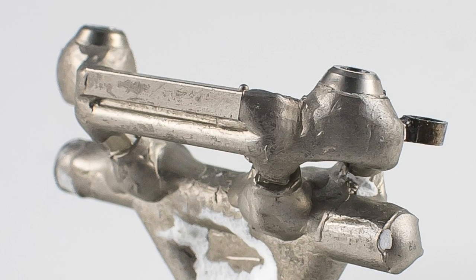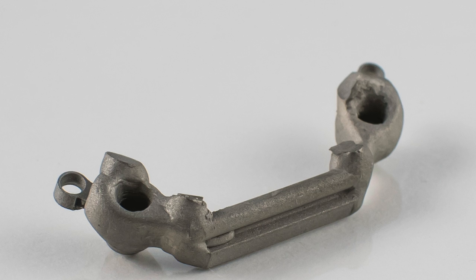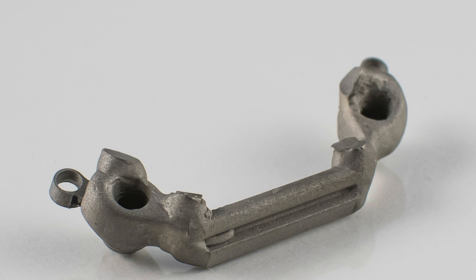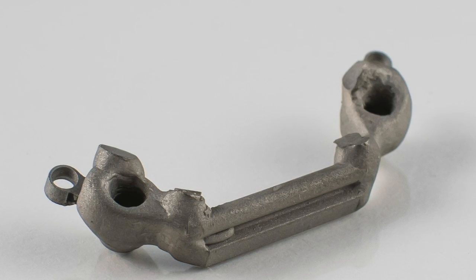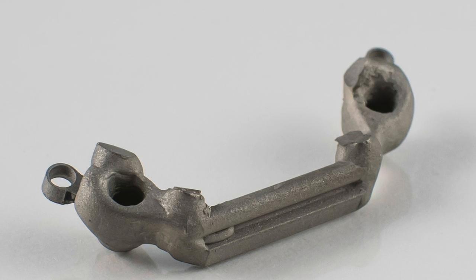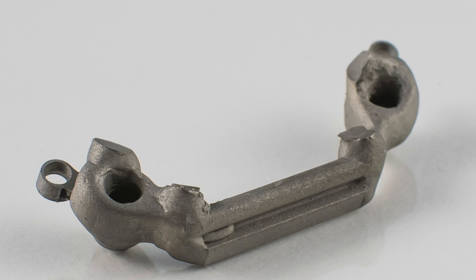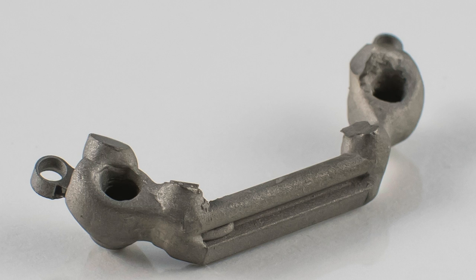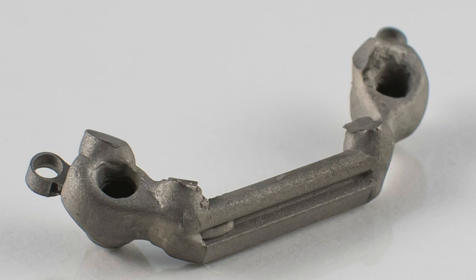Cut the bar off the runner bar and finish and polish. You will notice that I got an air bubble toward one side of the labial aspect of the bar. I did this to point out how important careful investing of the step area of the bar is. Well, what I actually showed was how, when you go too fast, you make mistakes. However, I was easily able to recreate the proper shape of the bar during finishing.